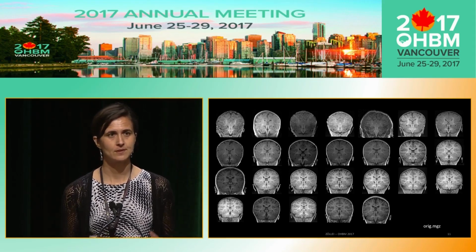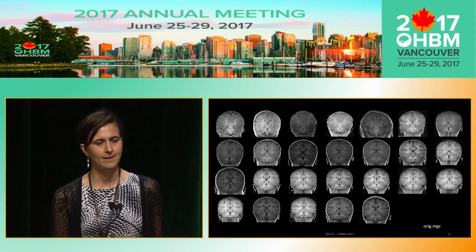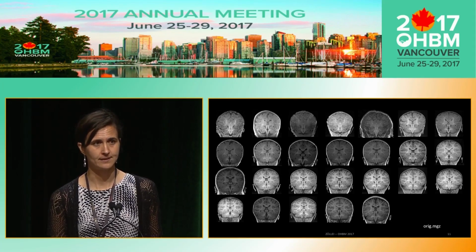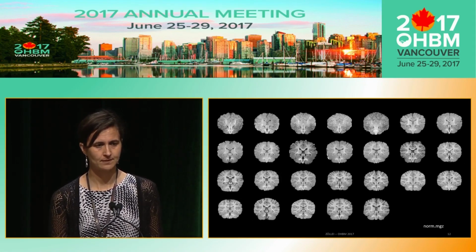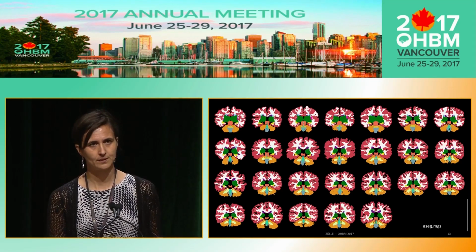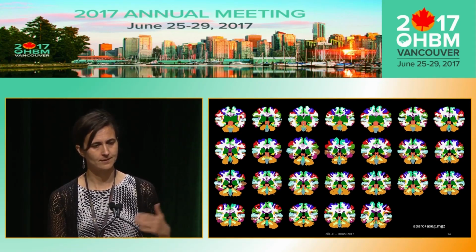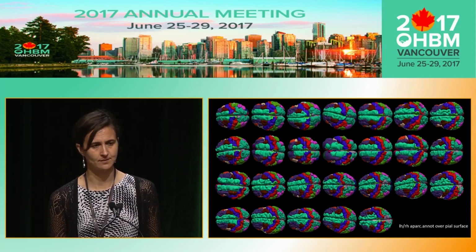I'm going to show you some images to indicate what kind of outcomes we get with this pipeline. This is an age-sorted selection of our manually labeled data set that is affinely aligned in an unbiased coordinate space. These are the input images, these are the skull-stripped versions, and these are the segmented versions, color-coded by the FreeSurfer color table. These are parcellated and segmented, so there are both cortical and subcortical segmentation labels. And these are the parcellation labels that have been projected to the pial surface.